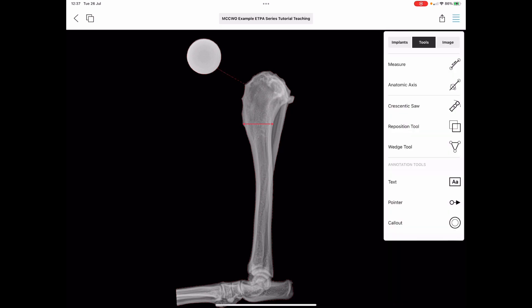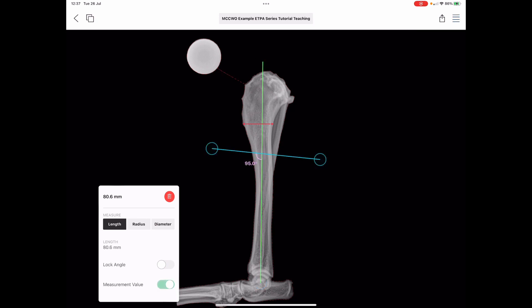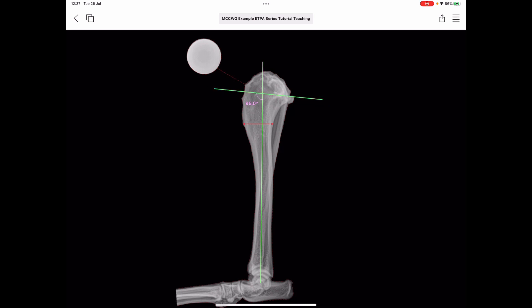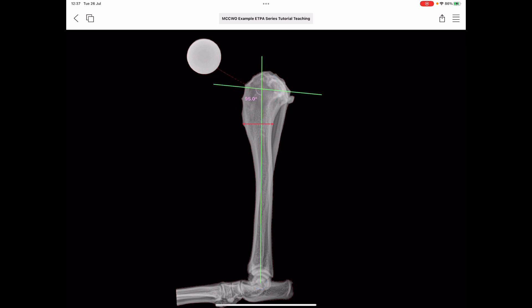The next thing to do is define the target. We need the line tool — two of them. We're going to draw our long axis extending from the distal landmark of the center of the talus. We take the measurement value off and bring in a second line: Tools > Measure. If our stifle is facing to the left, the second line comes in at five degrees off the perpendicular. That's our pair of target lines we want to see on our post-operative radiograph — that's our target.